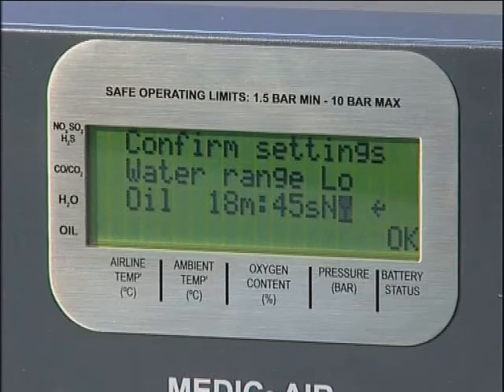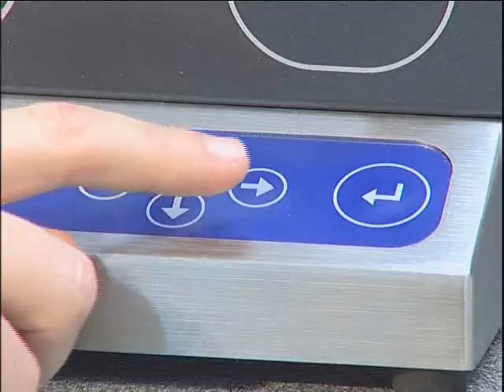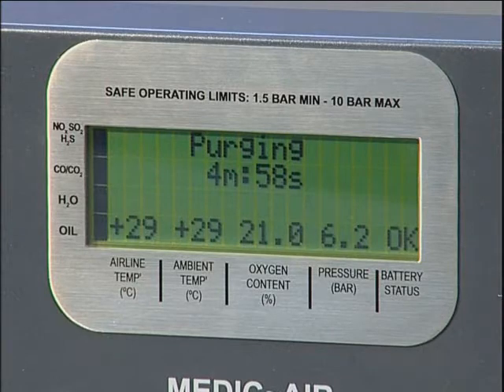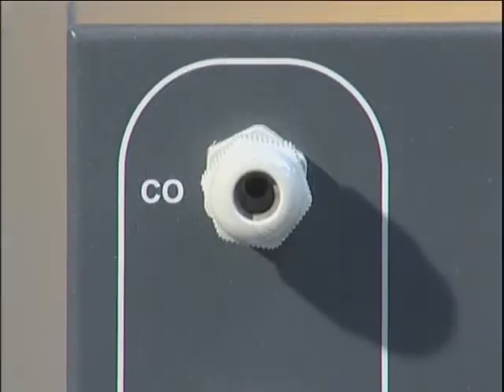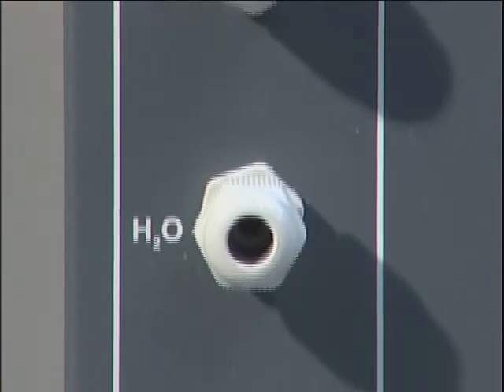Confirm that all settings are correct by selecting Y and pressing ENTER. If settings are not correct, select N and repeat the previous procedures, correcting any errors using the scroll buttons. Confirm the amended settings by selecting Y, followed by ENTER to move to the next screen. The unit will now commence a five-minute purge sequence, during which time an airflow will be passed through all seven tube ports. This clears contaminants from previous tests and ensures that a representative sample is being tested.